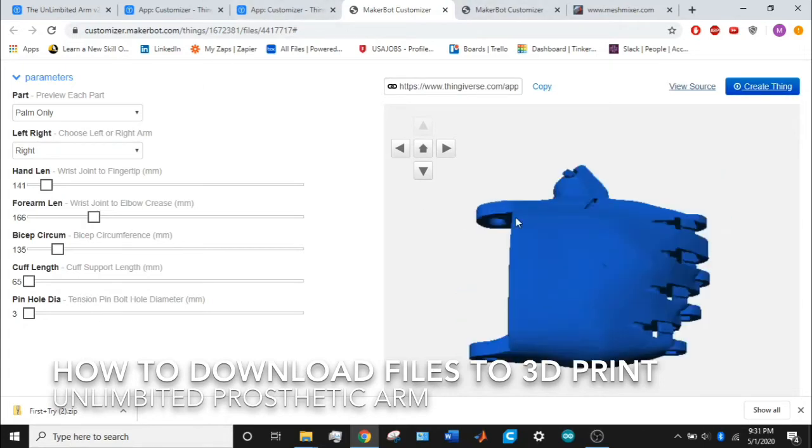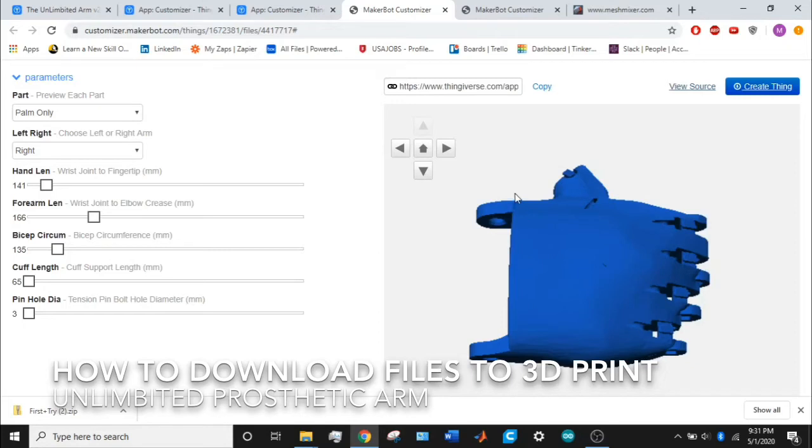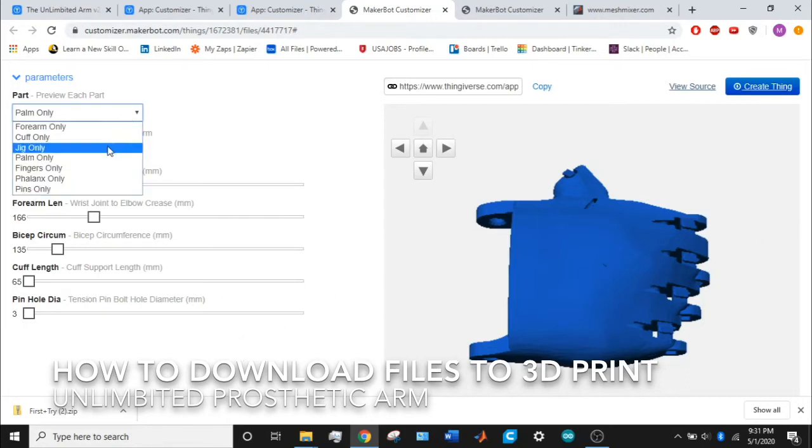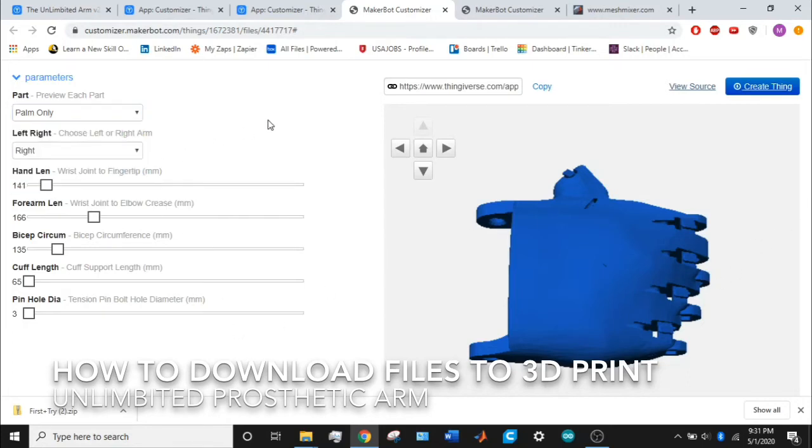The hand length wrist joint to fingertip is just the wrist joint right here where my cursor is, all the way to the edge of the fingertips, which is a separate part. You don't need to mess with that—that's already set in. You just need to work with the forearm length and bicep circumference.